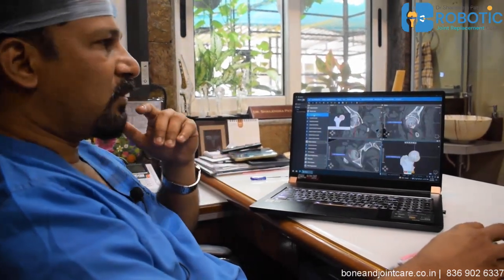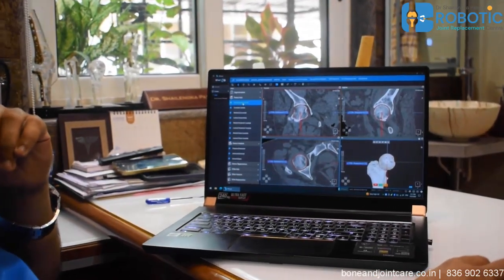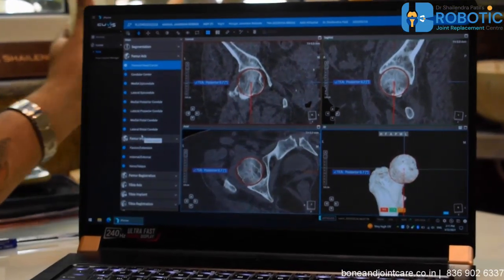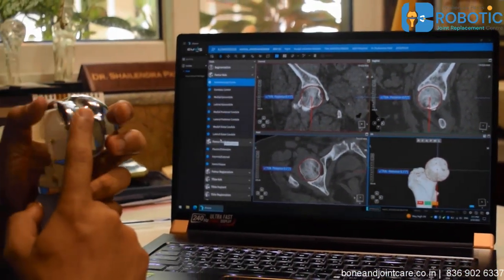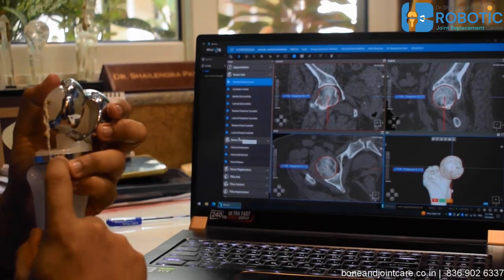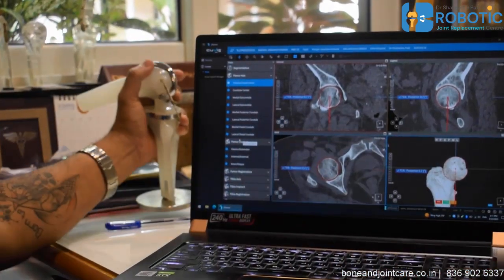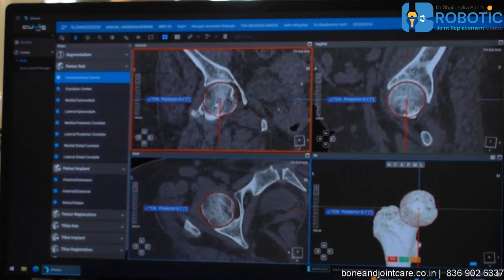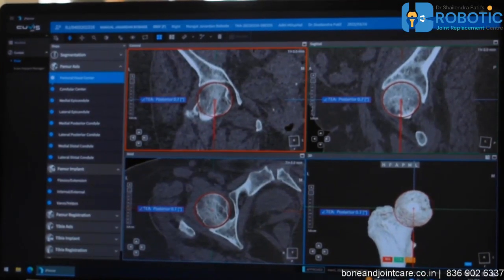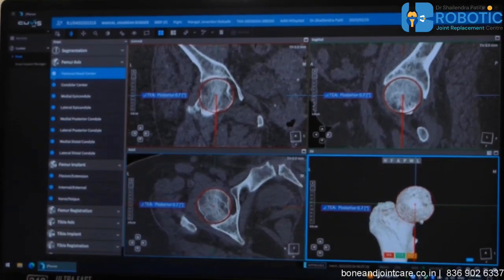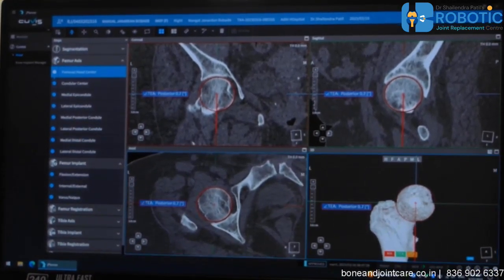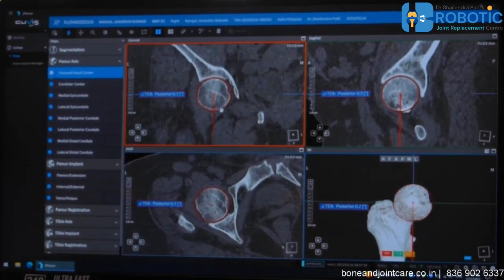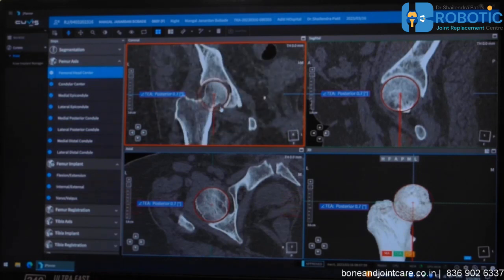After auto-segmentation, the system gives full details about the patient's leg. To plan the femoral implant — the thigh cap — it provides data like the femoral head center, which I can view in four planes: coronal, sagittal, axial, and a 3D model. In the 3D model, I can go millimeter by millimeter and check the accuracy of the points.